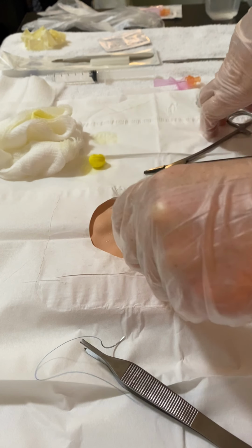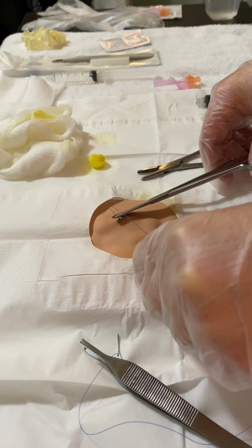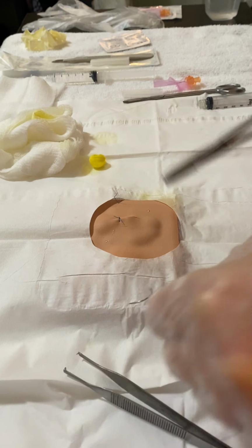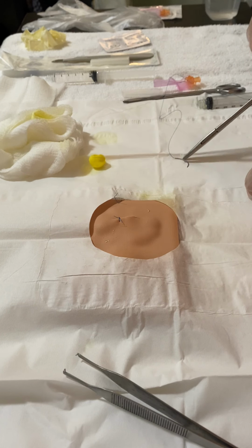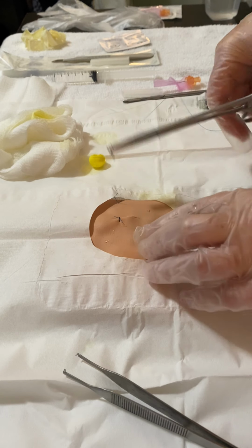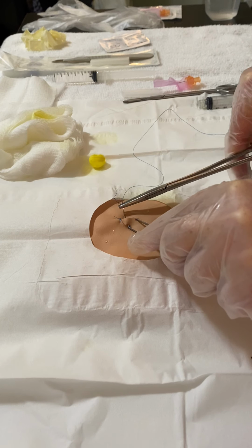And then from here we can trim. Then we can attempt the second suture.